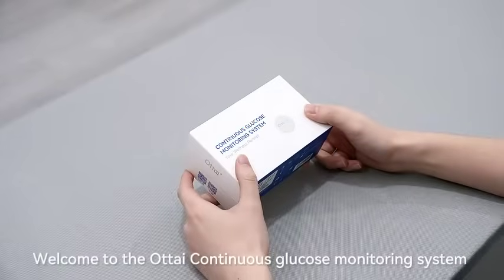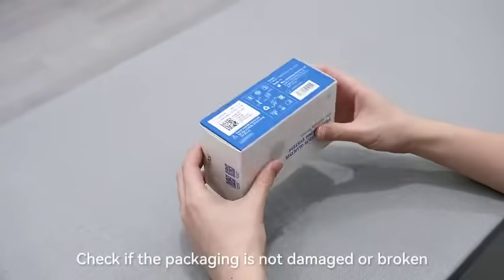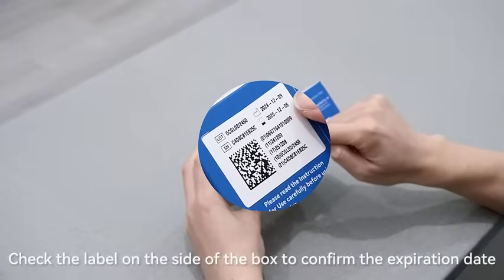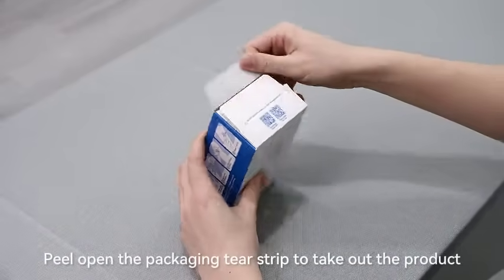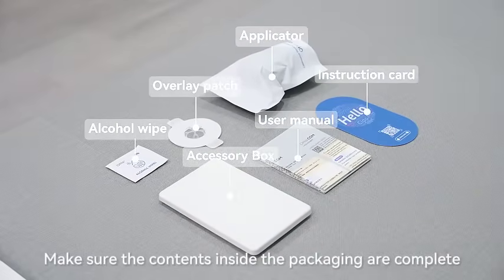Welcome to the Otai Continuous Glucose Monitoring System Application Tutorial. Check if the packaging is not damaged or broken. Check the label on the side of the box to confirm the expiration date. Peel open the packaging tear strip to take out the product. Make sure the contents inside the packaging are complete.